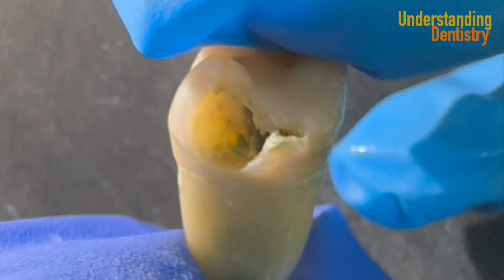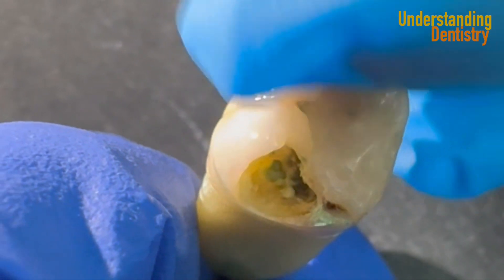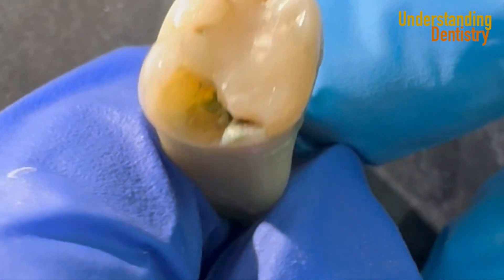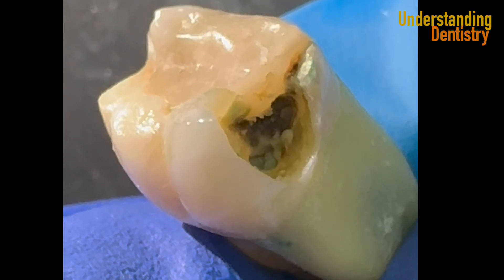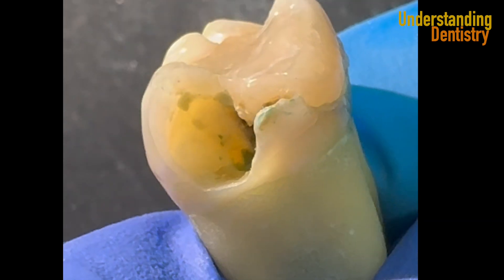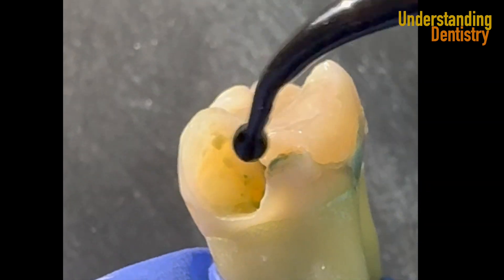Here we are showing the procedure in an extracted tooth. Of course the properties of the dentin are already not the same, but just for you guys to see the procedure in detail. Take a look — there are caries underneath the restoration. You still have part of the restoration and recurrent caries.